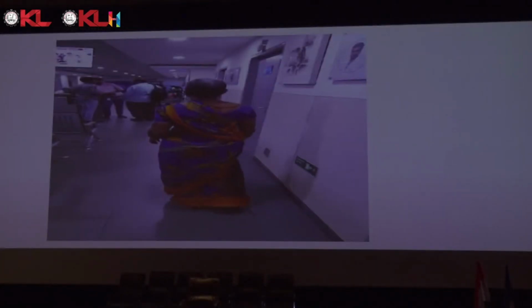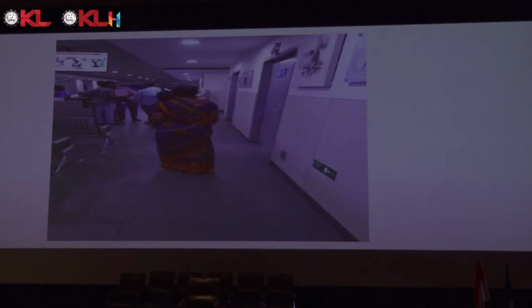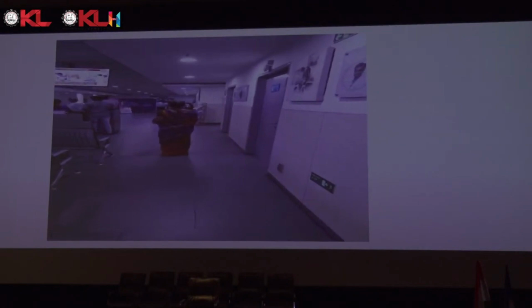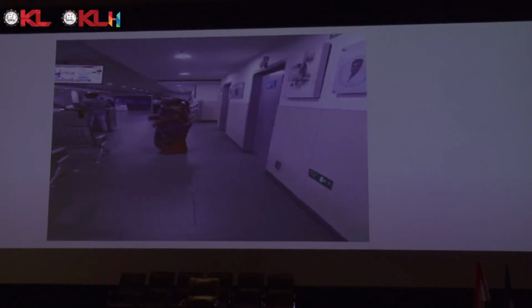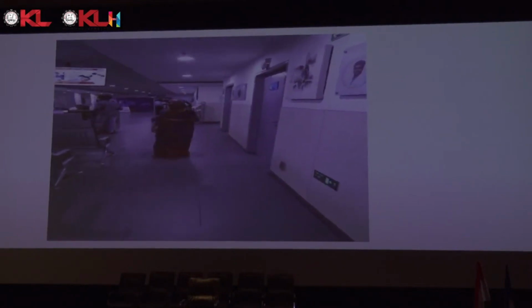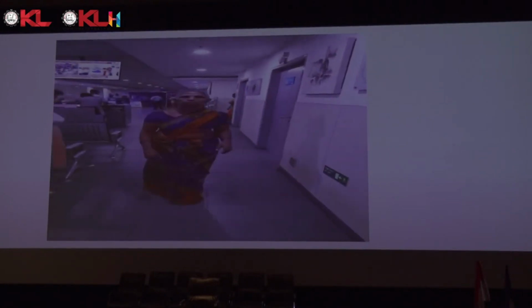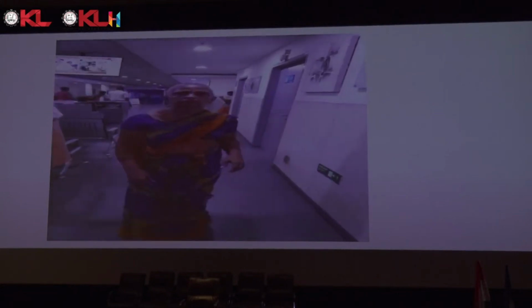So how do we select? Our neurophysician will select the cases depending upon the neurological condition, basically the UPDRS 3 score. For example, I will show. This is a case we have done. This Parkinson patient has bradykinesia, rigidity and tremor, all three. She was responding to Syndopa, but only for half an hour to 1 hour. If the dose is increased, she had significant dyskinesias.